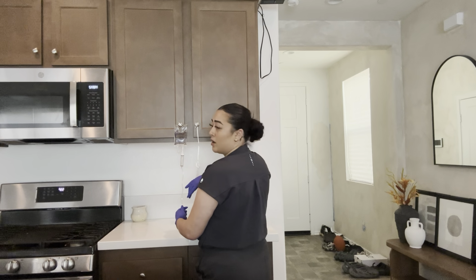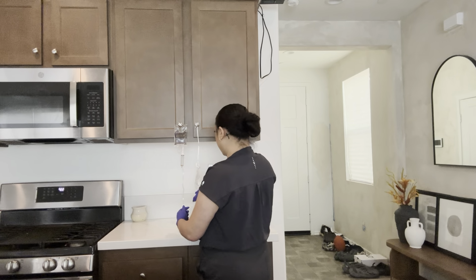And I see the drops going, so everything looks good, integrity looks good, medication looked good.